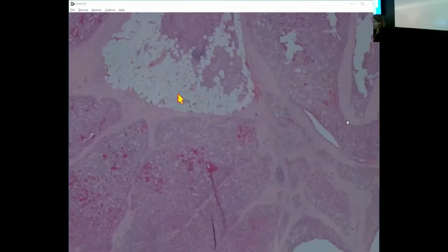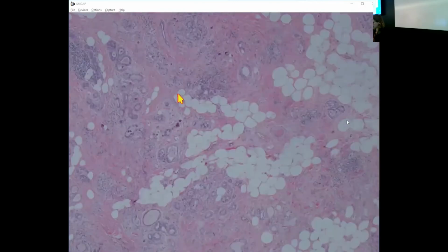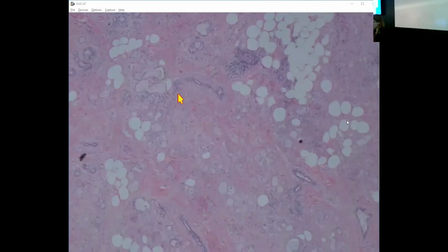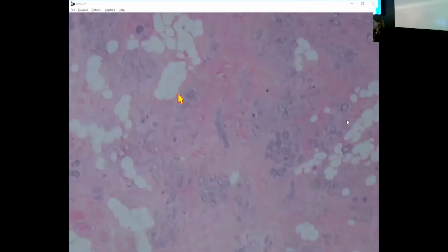All right, let's see. Since we talked about this entity briefly, oh, actually, you know what? I have the first. I just do have a nice example of MGA with immunostains, I think. So here's an excision on a case. Trying to find more of the classic.